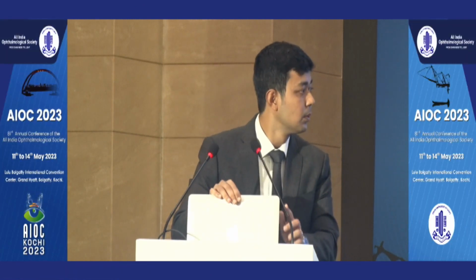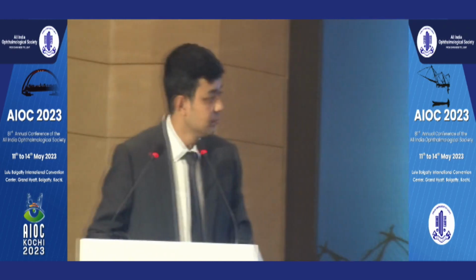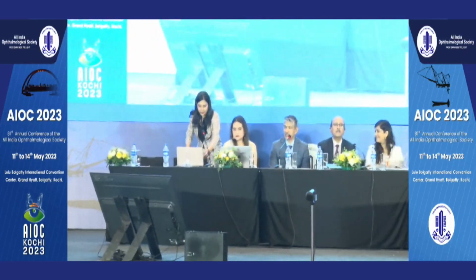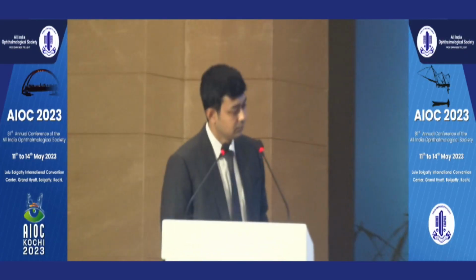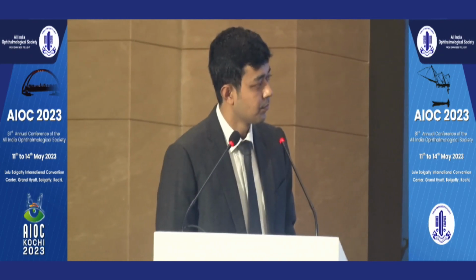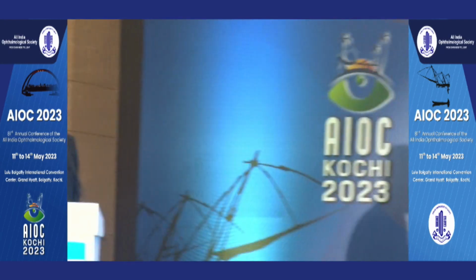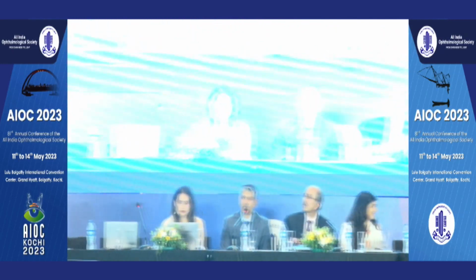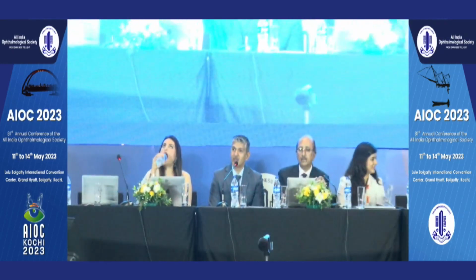Thank you, Dr. Shreyas, for that excellent coverage of biometric devices. Though we have technology advancement and newer devices coming in, like he said, if you cannot afford these devices, you can still use immersion biometry. And many of the formulas are available online. Yes, like with the APACRS, you have the entire Barrett suite. So you have access to that, and you can use the correct formula to get an accurate result, even if you have immersion biometry.